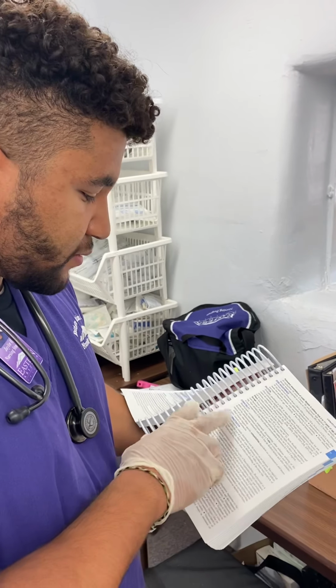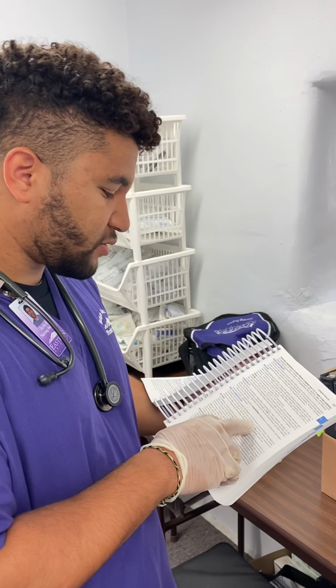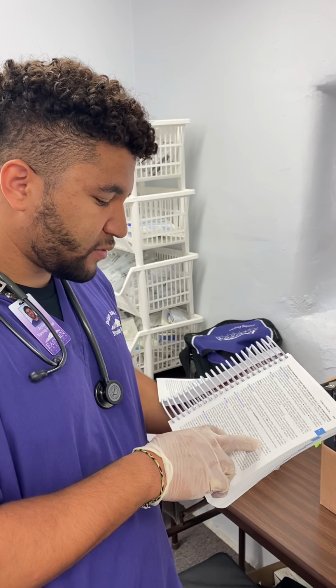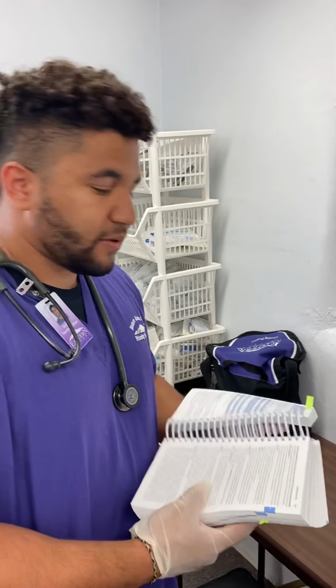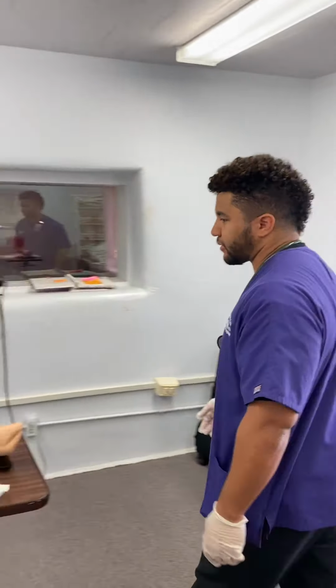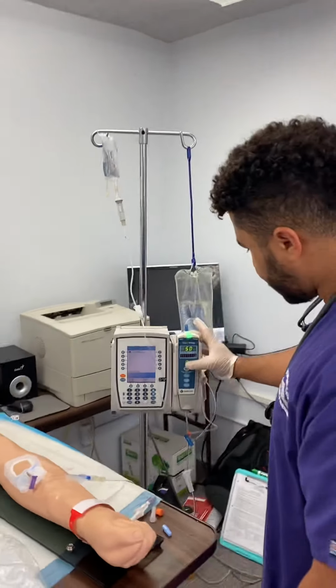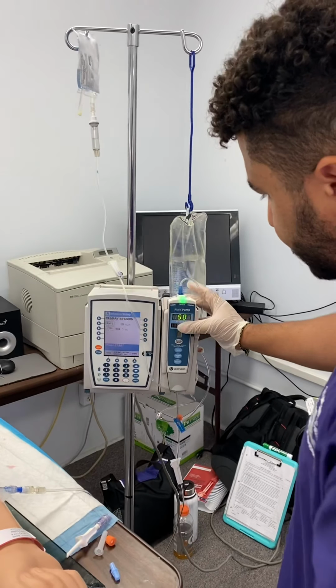And then you come over to rate of administration. A single dose must be equally distributed over 60 minutes as an infusion. So now that we have those parameters, we can go ahead and use our pump and set it up. You're going to come over here to channel select and press that button.